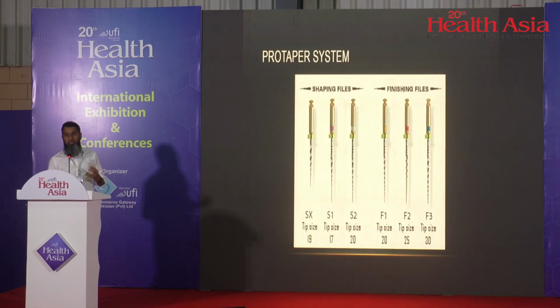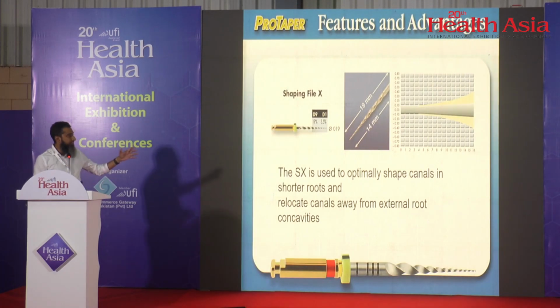So I'll just talk a little bit about one of the systems which is available, which is the ProTaper system. Because in rotary, you have different systems available. But just as a guide, the most commonly used system here is the ProTaper system. So I'll just give you an initial guide on how to go ahead with this system so that you can get a good result. Maybe most of you might know about it. It comprises 6 files, 3 shaping files and 3 finishing files. The first shaping file is a short file. The main purpose of it is for use as a coronal flaring file. So you enlarge the coronal part with this. This does not need to go all the way to the apex.